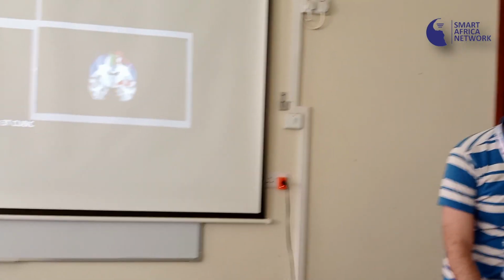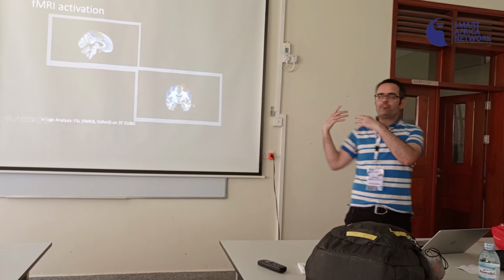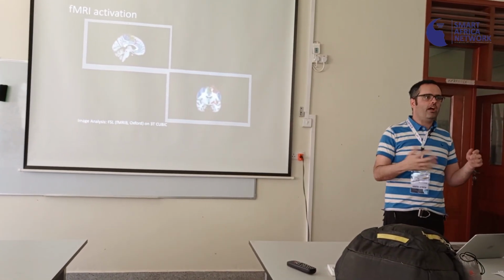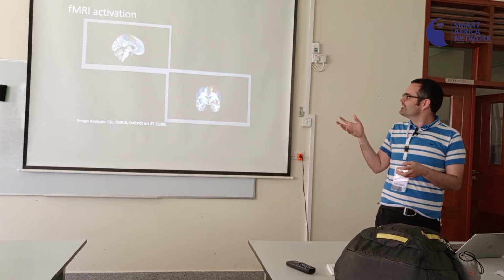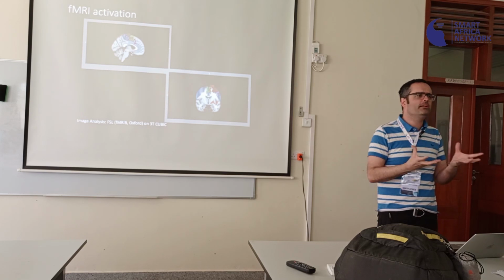And we can see here, you'll have to believe me if your neuroanatomy is a bit hazy, that the motor cortex is activated, parts of the basal ganglia, and also the cerebellum on the opposite side. This was one of the first studies we did just to see, does this technique, which everybody does overseas, actually work for us? And we can see that we can actually get a reasonably accurate signal.